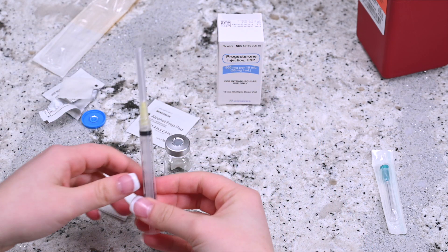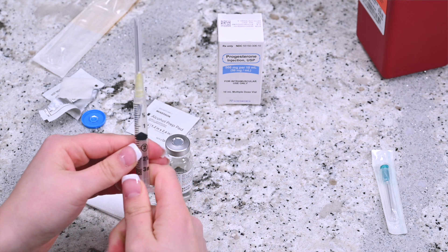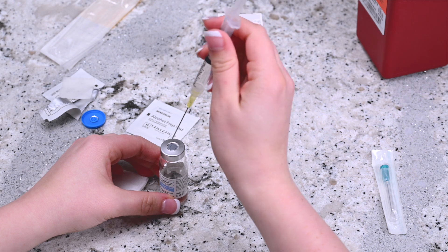Take the syringe with attached needle out of the packaging. Hold the syringe upright and draw in the same amount of air as the dosage required. Place the needle into the rubber stopper on the vial and press down on the plunger until all the air transfers into the vial.